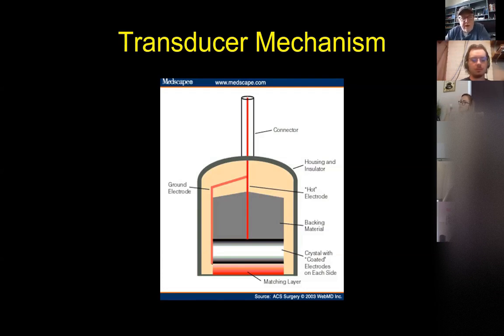The other thing I should probably say here, that I'll say more about coming up, is ultrasound does not penetrate through gas. It can't penetrate through gas or bone or metal. All of those are super strong reflectors. So if ultrasound propagates through your abdomen and sees a gas-filled bowel loop or a stomach that's got a bunch of gas in it, it will reflect 100% of that sound back to the probe, and you can't see anything in the stomach at all that's full of gas.